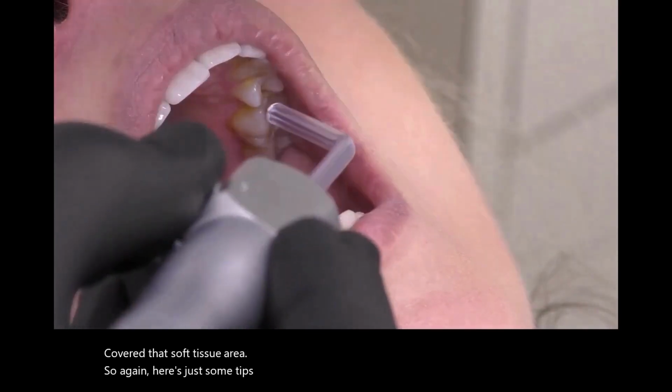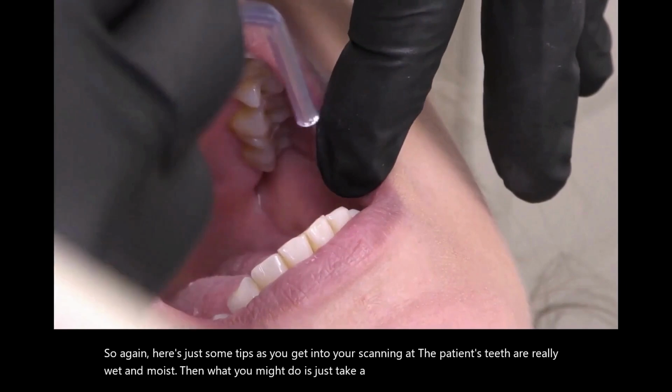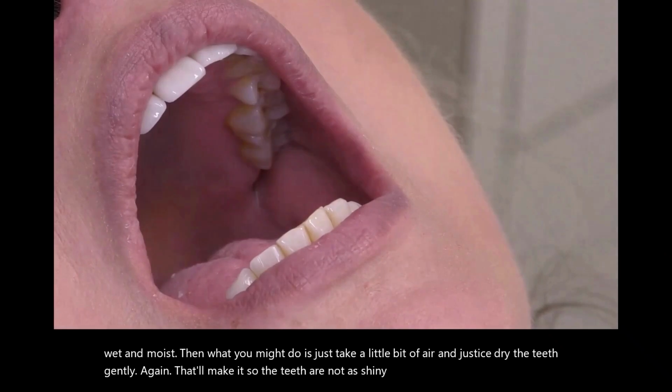As you get into your scanning, if the patient's teeth are really wet and moist, then what you might do is just take a little bit of air and dry the teeth gently. Again, that'll make it so the teeth are not as shiny. That'll make it easier for the camera to capture the contours of the teeth.